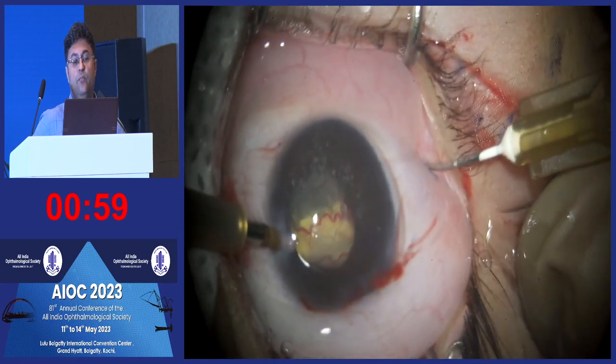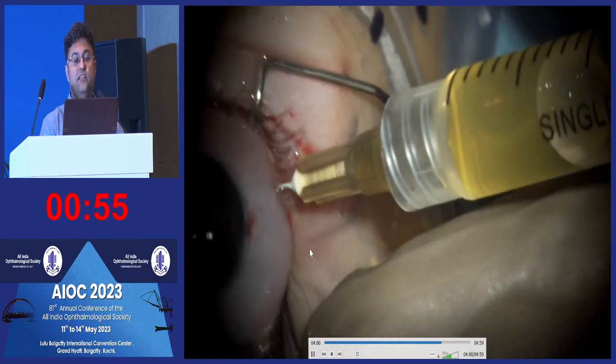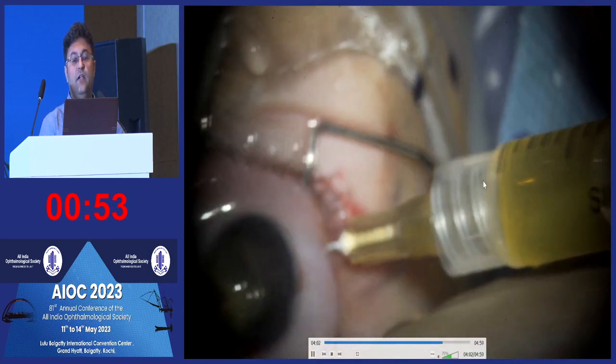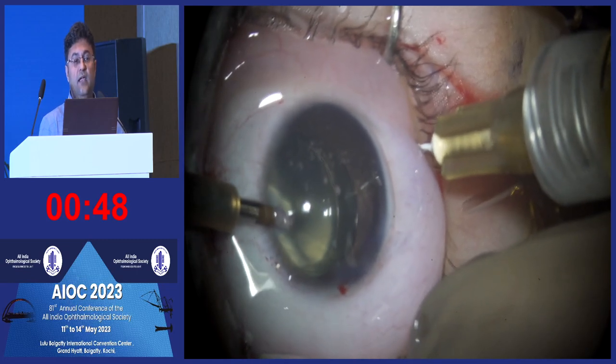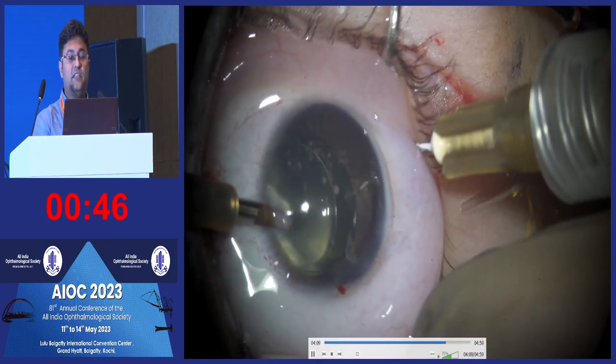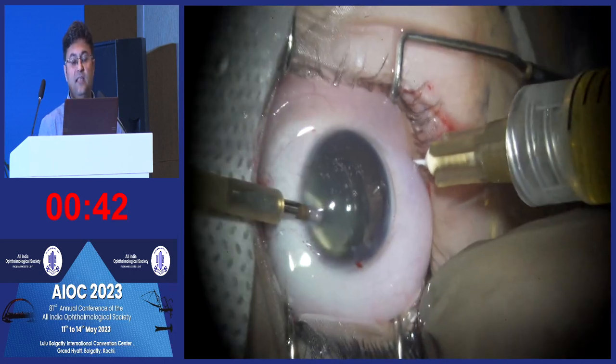So what we did is then put the infusion cannula in. And you see here with a 26 gauge needle put around 6 millimeters from the limbus, you see the drainage of the Coats fluid that is taking place. We are not going really inside the eye and draining the Coats fluid externally. You see this yellow reflex gradually disappearing as the retina falls back in place.